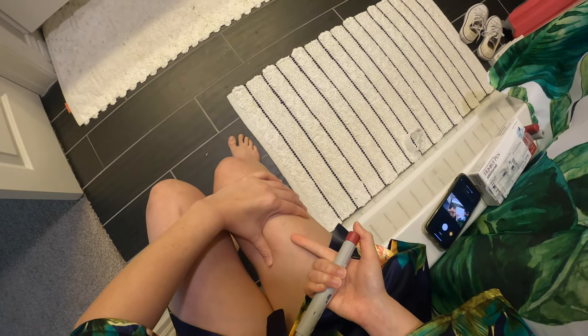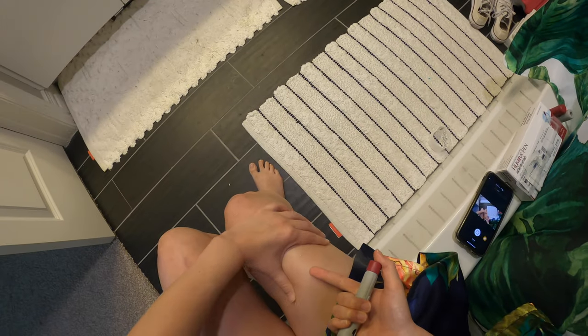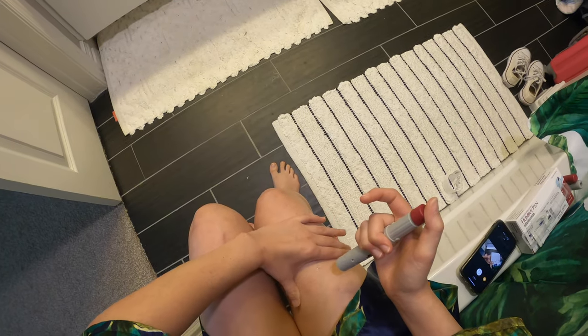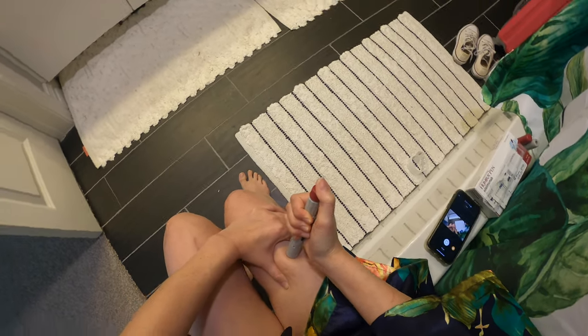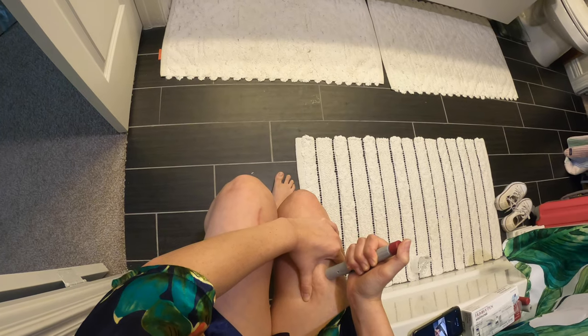You can see this is how much medication has dripped out — this amount of liquid that's on my leg. I'm just stalling. Three, two, one.